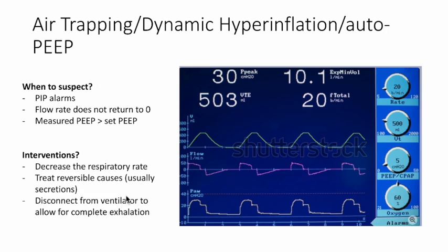And this may even include the application of external pressure with your hand to the patient's chest to assist in complete exhalation. So severe air trapping is not common, but it's something that you should understand and have on your differential when you see high peak pressures.